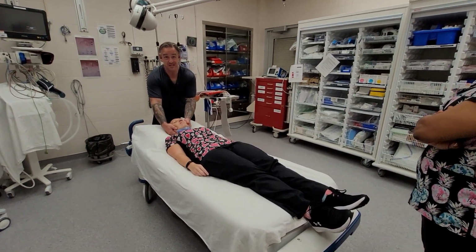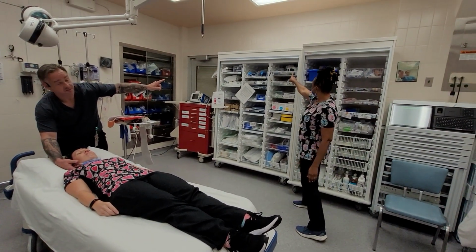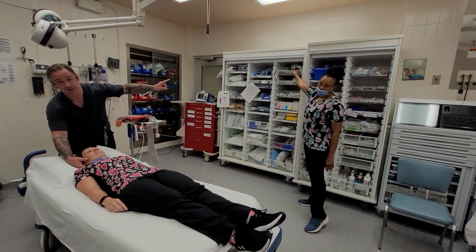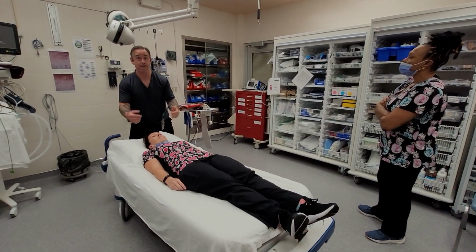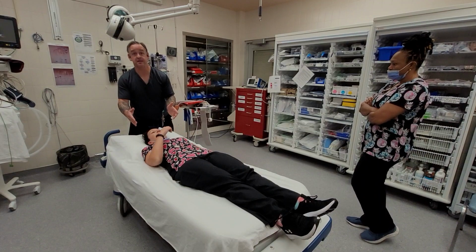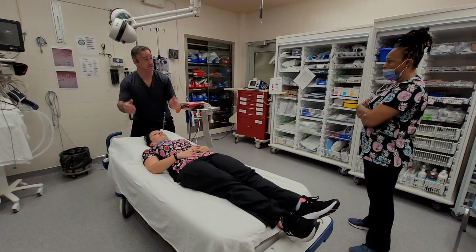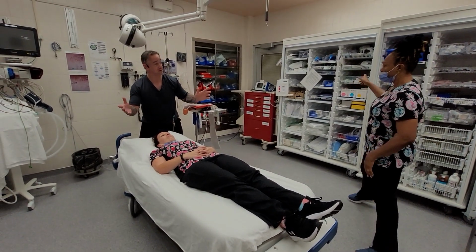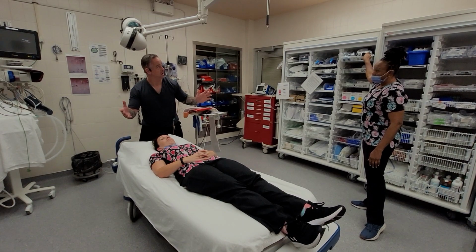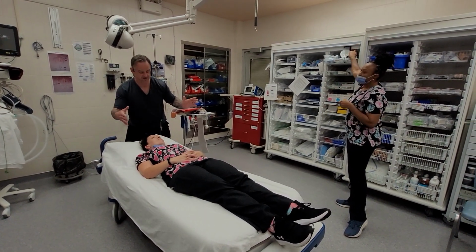If they do not have a C-collar, over there in the cabinet, we have C-spine collars. Any patient who has a major multi-system trauma should have a C-collar on, period. If EMS didn't bring them with one or they didn't come by EMS, throw a collar on your patient immediately, because it needs to happen. There's stuff on the internet on how to put them on. We'll actually do that in a separate video if anything. I want to do the pelvic videos for now.